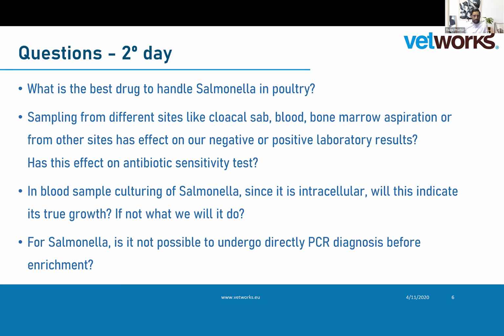For Salmonella, is it not possible to undergo direct PCR before enrichment? No, you have to culture it before. Yes, that's correct.